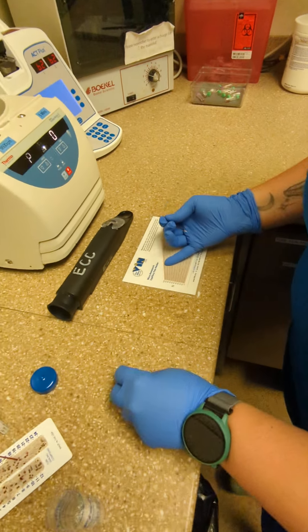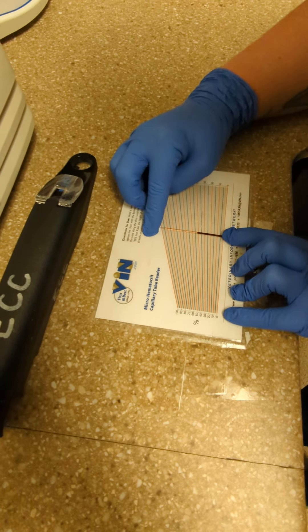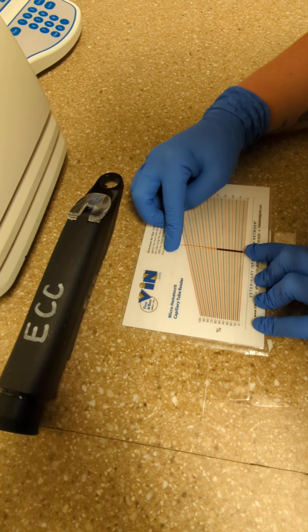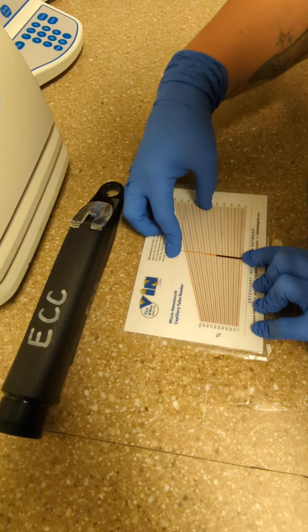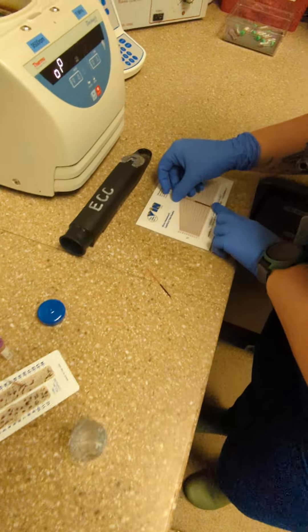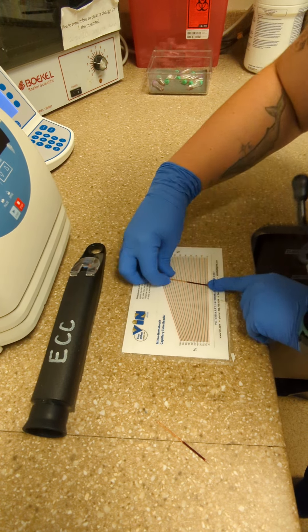To read them, use your hematocrit capillary tube reader. Line up your blood at the bottom and your plasma at the top, then roll until you find it. Follow it up diagonally — this one would be 35. We always check both at our clinic to make sure they are equal. So, 35.